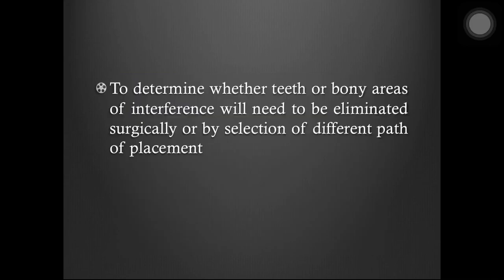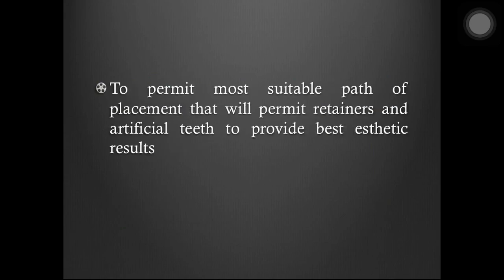Also, another purpose is to determine whether teeth or bony tissue areas of interference will need to be eliminated surgically or by selection of a different path of placement, to permit the most suitable path of placement that will permit retainers and artificial teeth to provide the best aesthetic results.